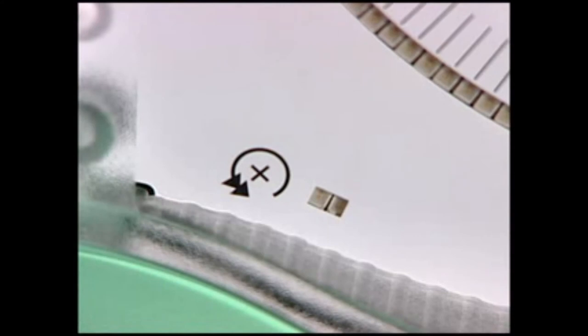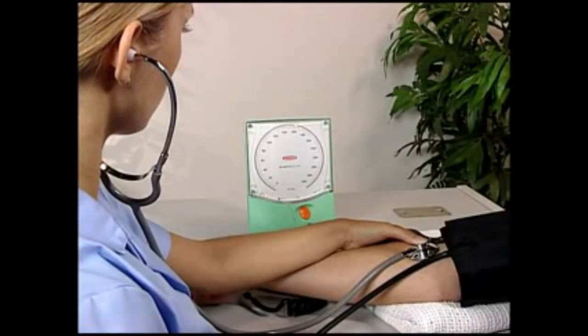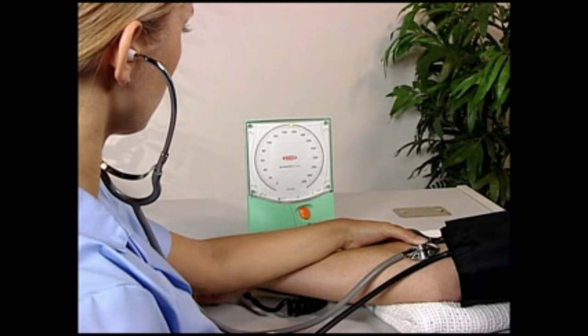If the deflation rate is faster than 3 millimeters of mercury per second, one of two amber indicators at the bottom left of the dial will come on. The position of the indicators just below the pressure dial, and the use of different colored lights, allows them to be seen out of the corner of the eye without distracting from the main pressure display.